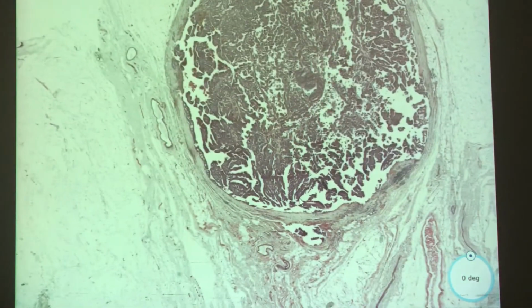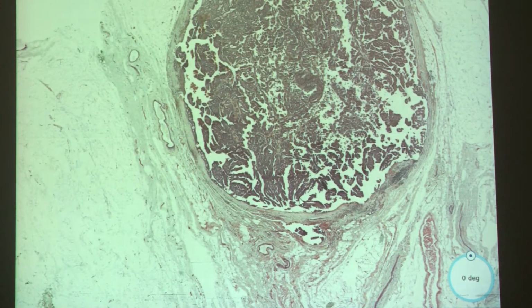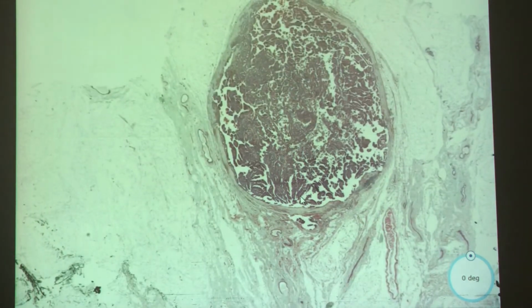Go with it. Papillary carcinoma. I love it. Okay. I love it.